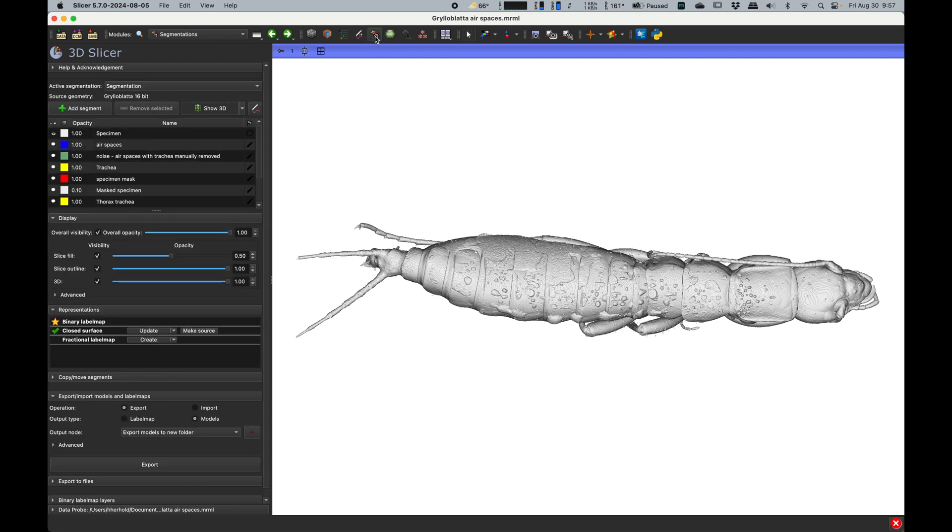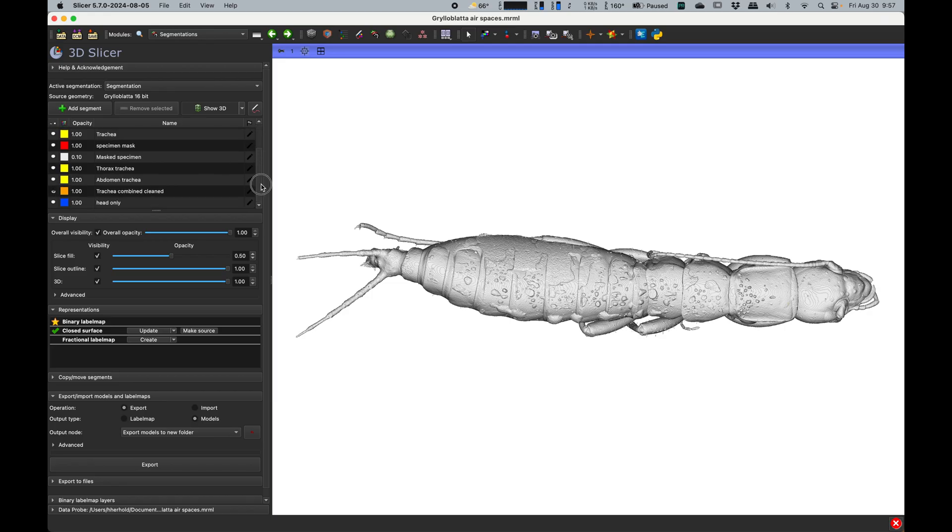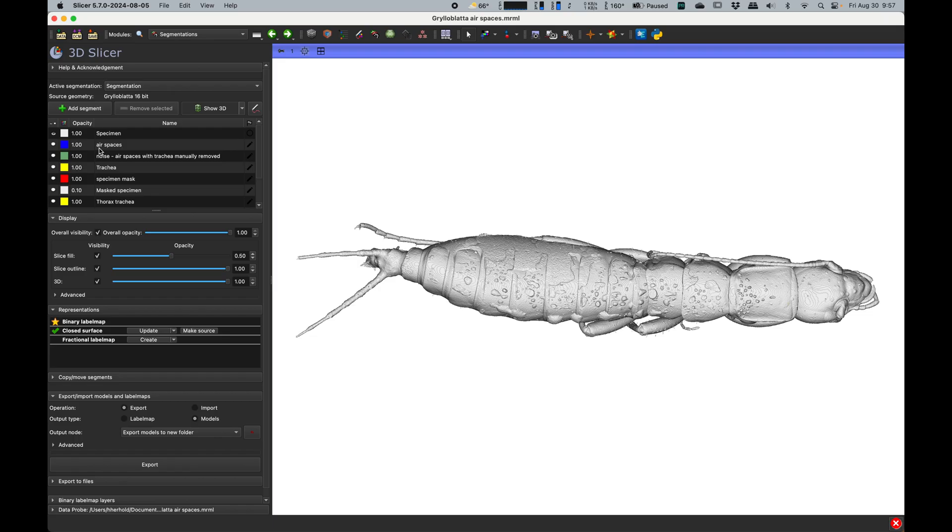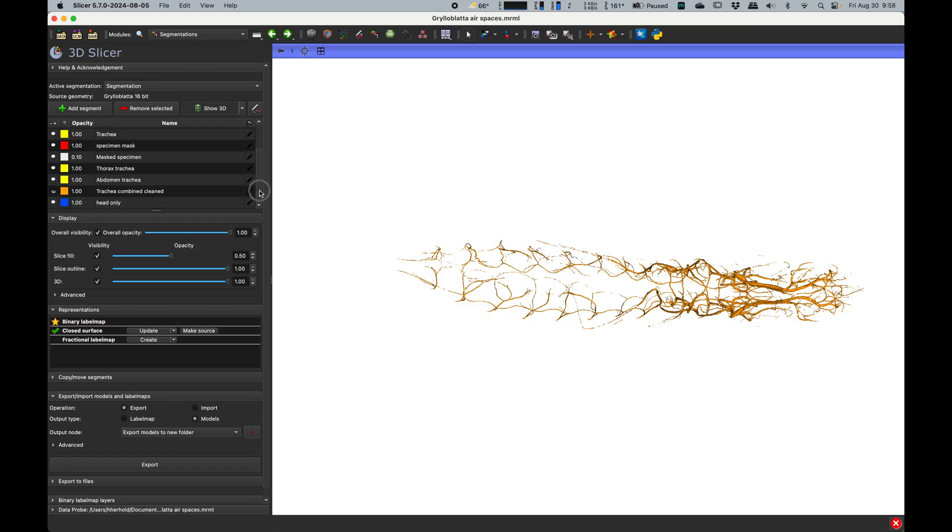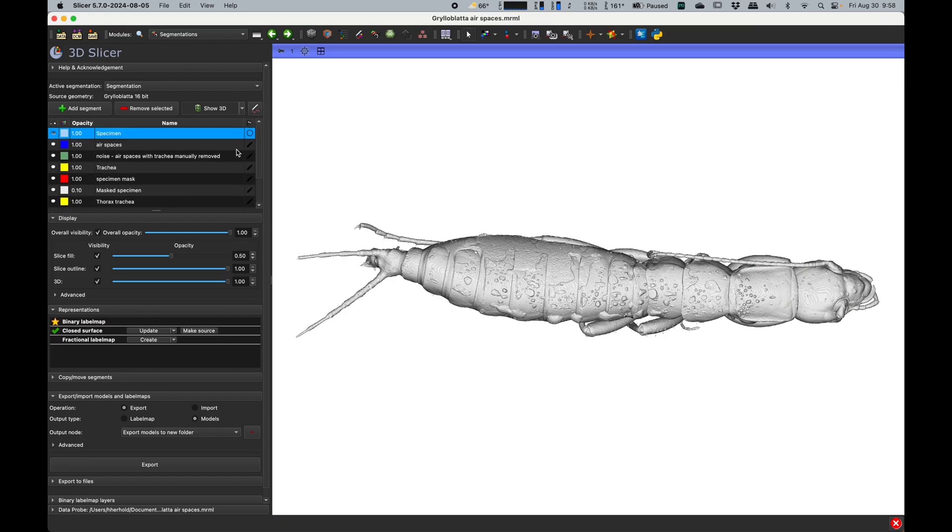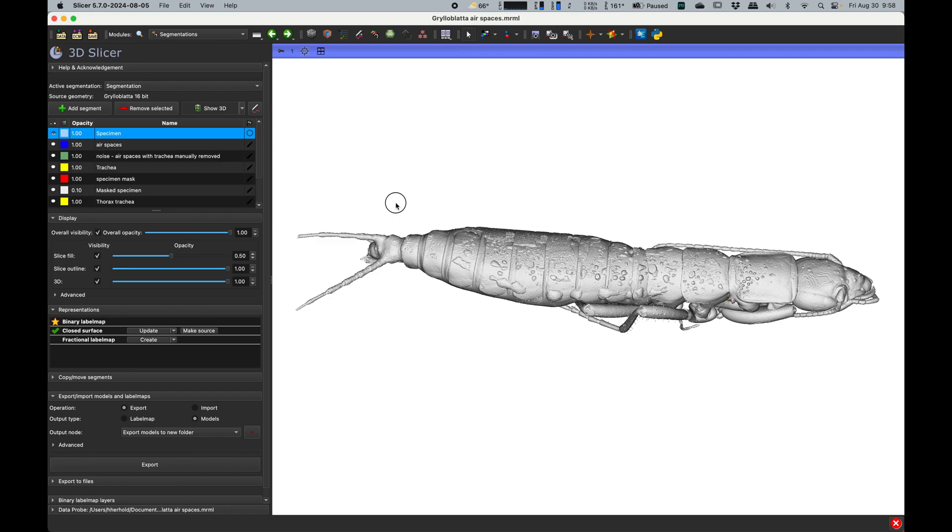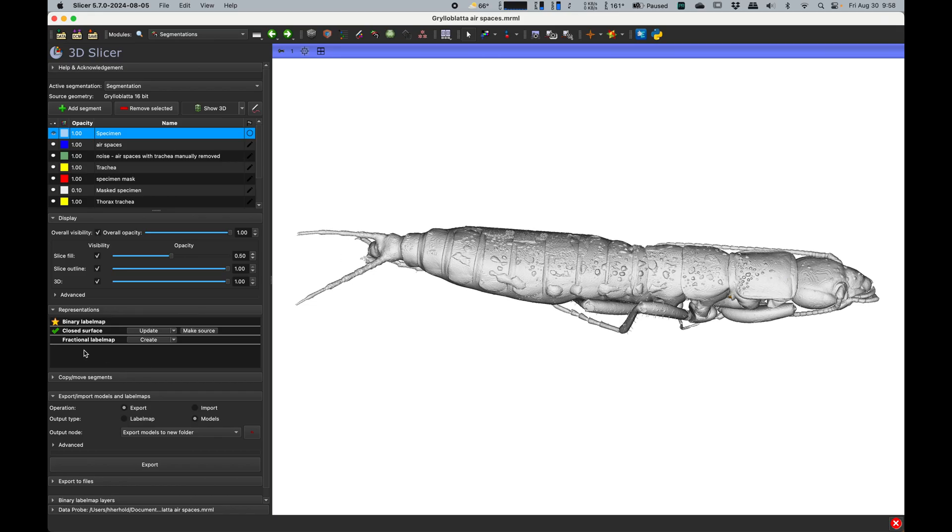We want to pick just the visible ones that we want. We make visible the ones that we want to do. For example, here I want to do the specimen and the trachea, so there are only two segments here that I want to use.